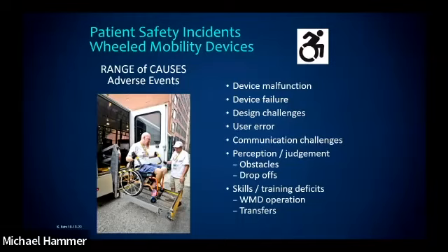We've also seen those types of falls where an individual, again, visual field, user error, lack of training, whatever that might be, is not perceiving where the curb is. Where is the curb? Where is the flight of stairs? Worst case scenario, and we don't share all the details of where things occur, an individual going home on like a first pass to go home for the day and see how they're doing before they come back to their institution, and out on the back patio, not understanding where the flight of stairs going down to the main level of the backyard is, and a fall with a power wheelchair can be catastrophic there.